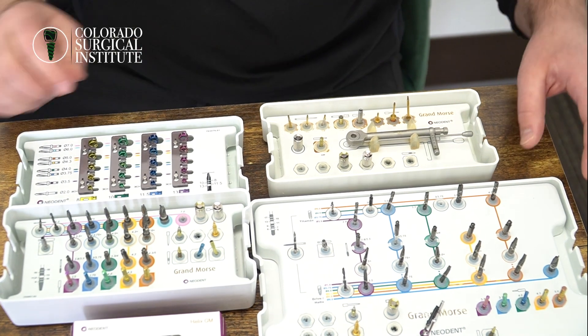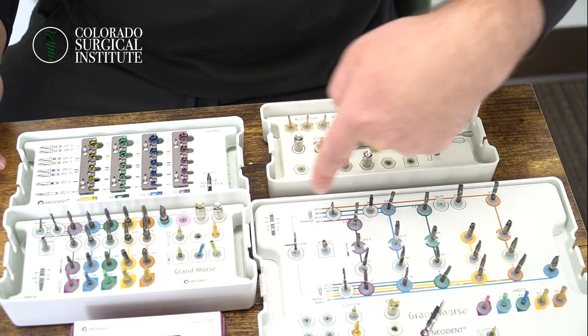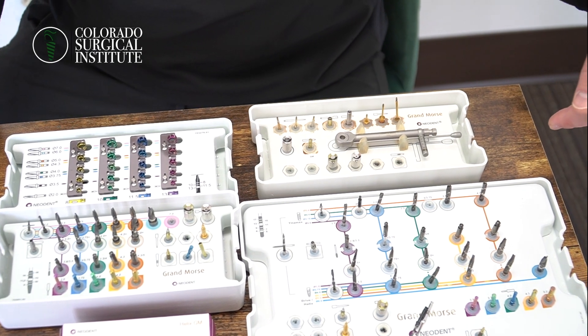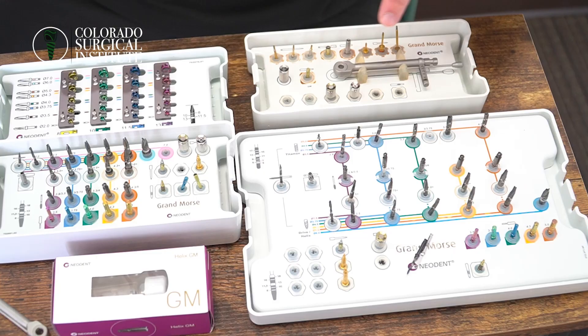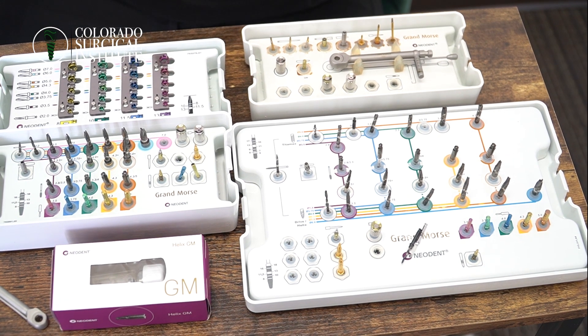When we're looking at Neodent's full kit, this top line is for the Titamax implant. The Titamax implant is really a cortical implant made for very, very dense bone. It's a straight implant. This kit can also be used to do a Neodent Drive implant and a Neodent Helix implant — literally everything.